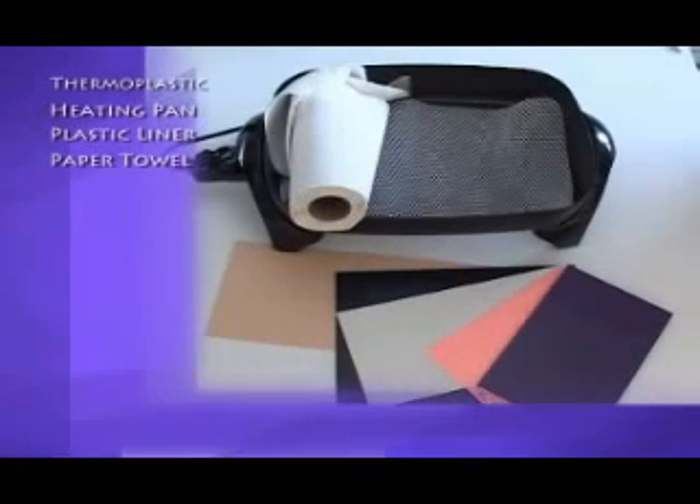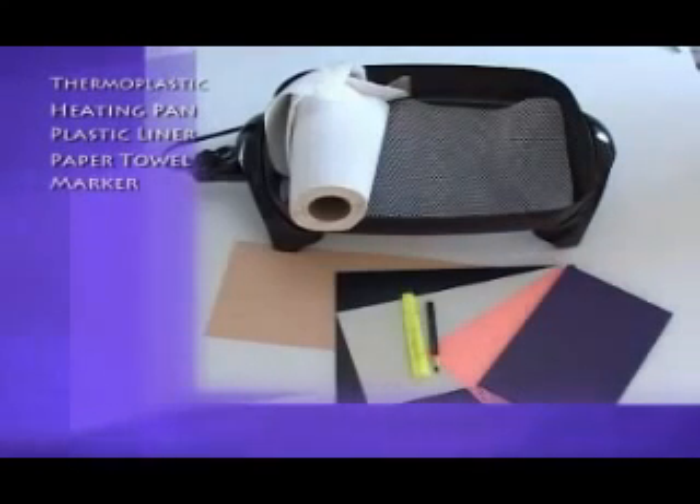A few sheets of paper towels work well to trace the shape of the animal's limb to make the splinting pattern. A magic marker and a waterproof marker or wax pencil is used to trace the shape of the limb and then to draw the cut paper pattern onto the thermoplastic.